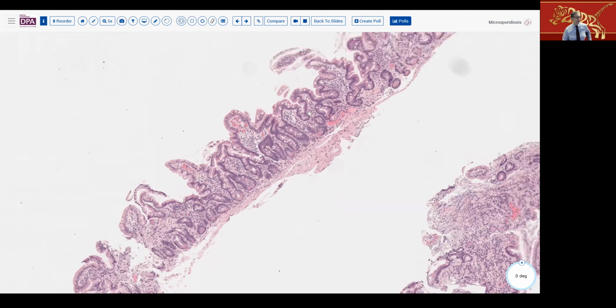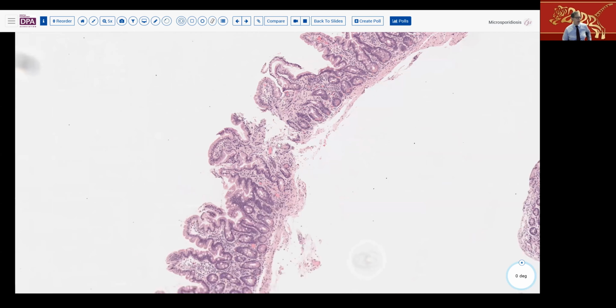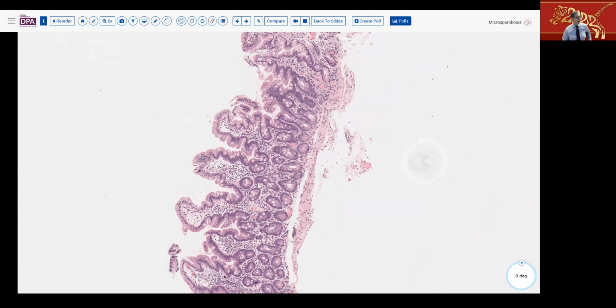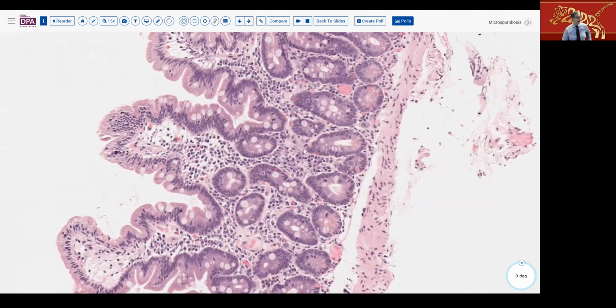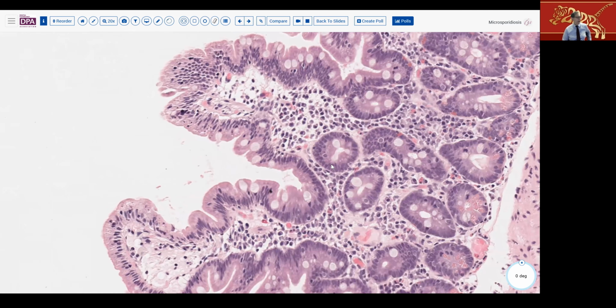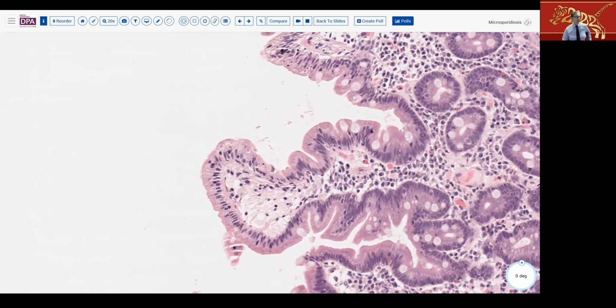So we'll go down and just sort of start taking some scanning looks at what's here. The villus architecture is not blunted. The crypts appear relatively free of inflammation. And actually looks like she ought to be fairly able to absorb things, just looking here at low intermediate magnification. However, as we go a little higher here, you may begin to notice that there's just a little bit of busyness in some of these villus tips. A little bit of a funky look in some of these cells. And here's a few darker staining areas here.